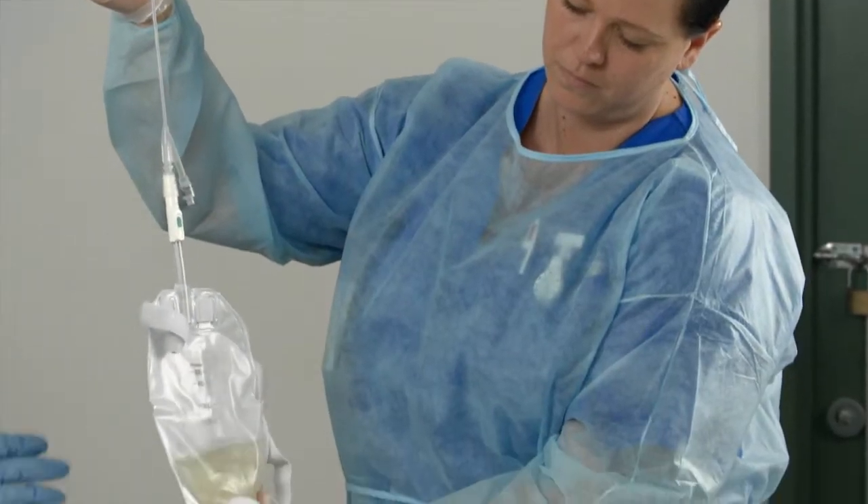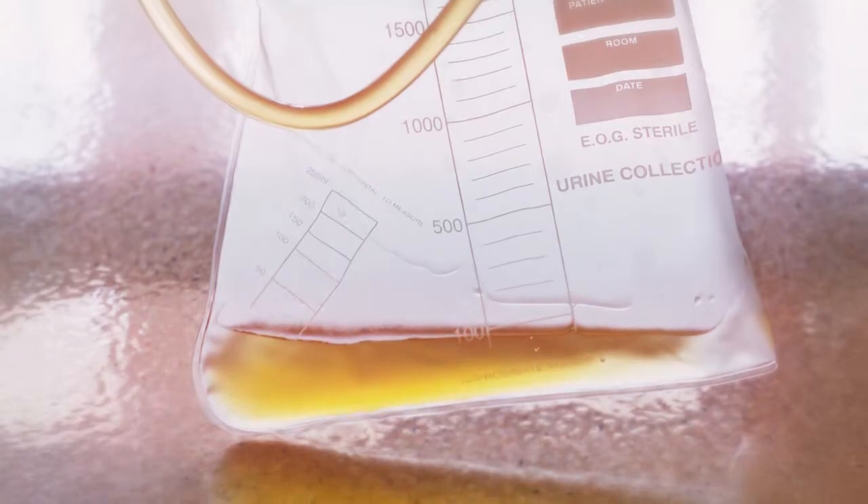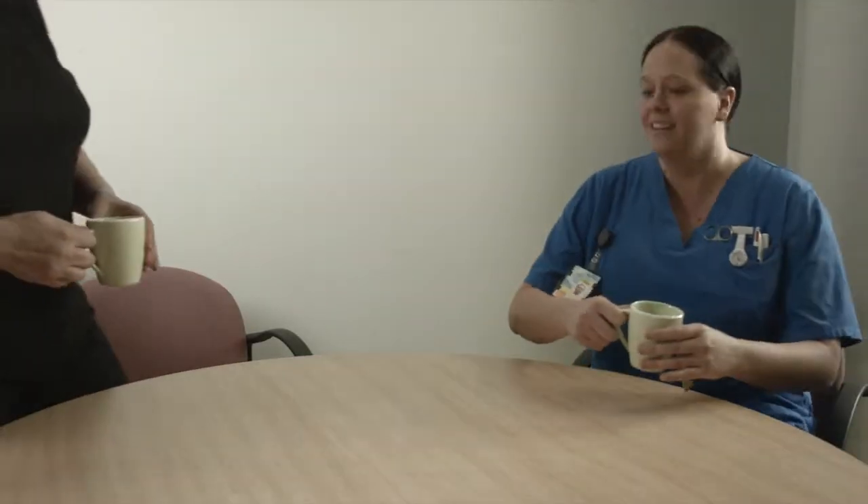What we're looking for is to see the tips aren't blocked — it's sediment. There are so many catheters out there on the market.